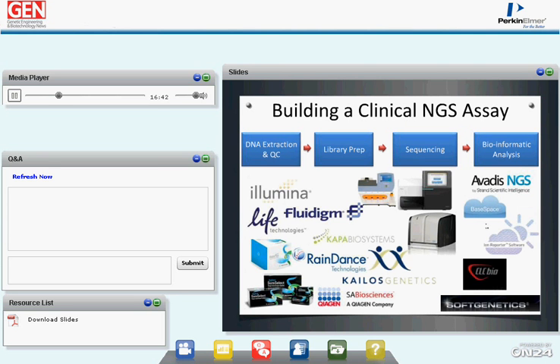On top of all of these different components, there's a lot of commercial competition, so there's a lot of different options. And as you're starting to build a laboratory, as we did about a couple of years ago, it was very difficult to try and identify which of these technologies was the most robust. And about every 6 months, we're seeing a turnover.